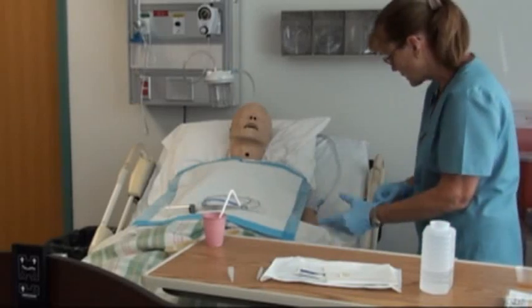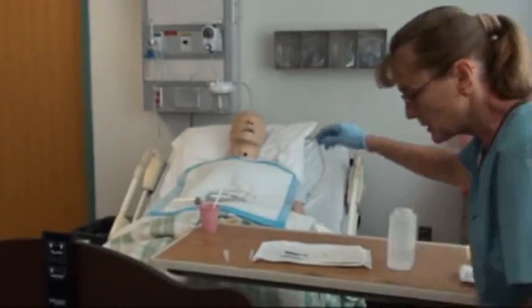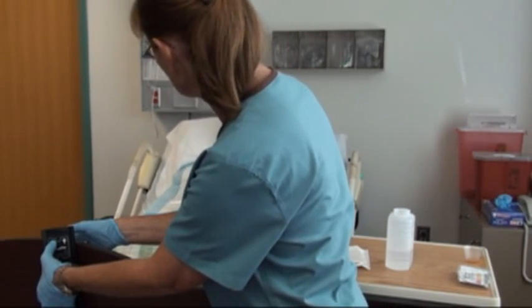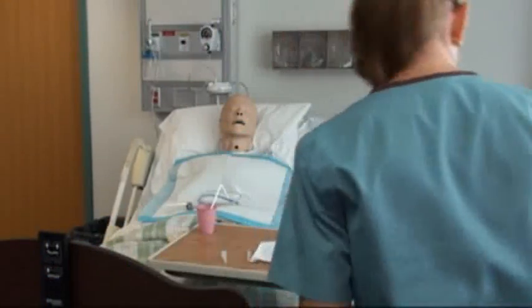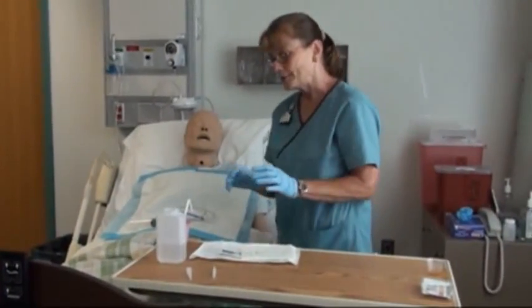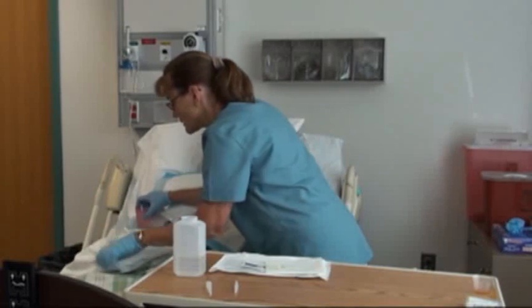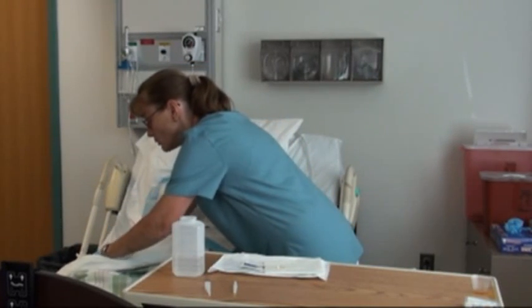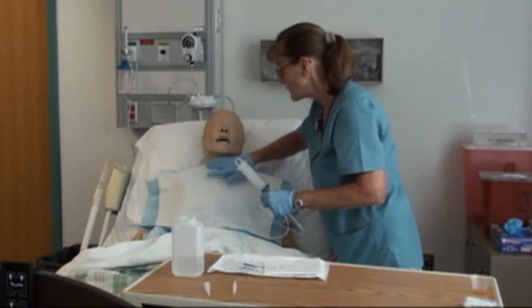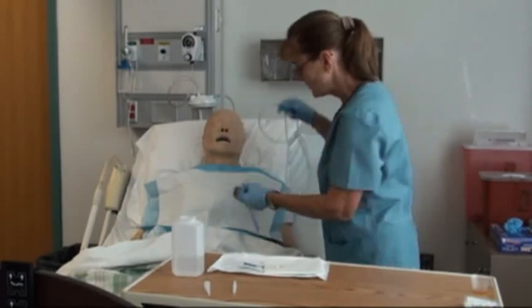Put the head of the bed up to about 60 degrees. Once the tube reaches a certain point, have the patient sip water to help advance it. Never push the tube unless the patient is swallowing, because you'll be fighting against the esophageal muscles. Also, if they're not swallowing, they're probably breathing — increasing the chance of the tube going down into the trachea.